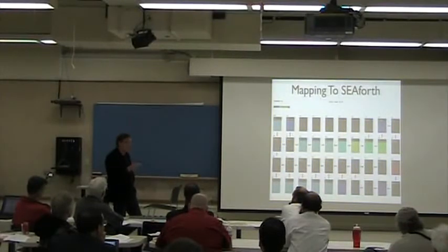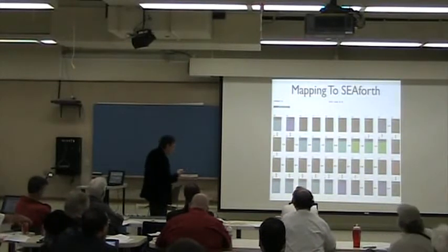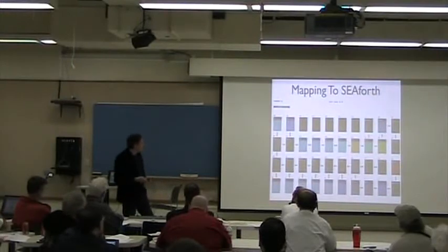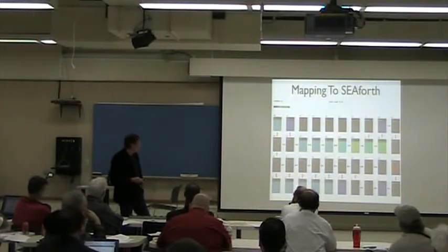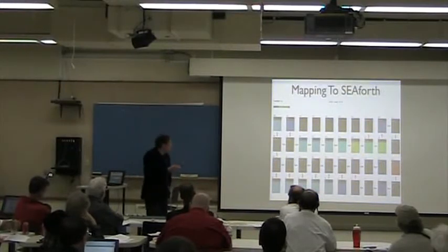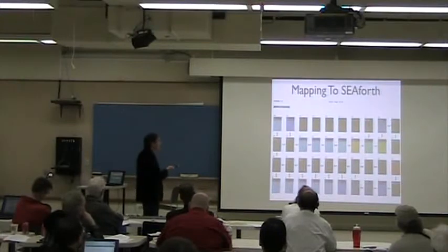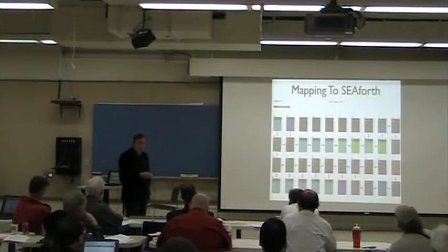It's displayed differently in Firefox, Safari and Chrome, but still it's much better than HTML. So we decided to go with SVG. So this is the heat map of the real Hearing 8 application running in simulation mode.